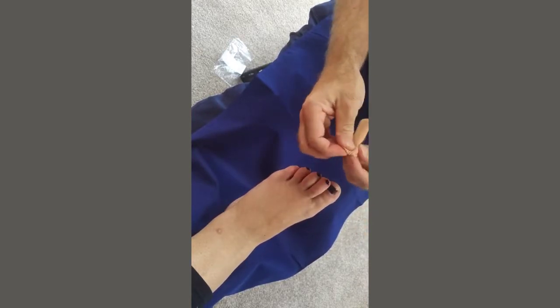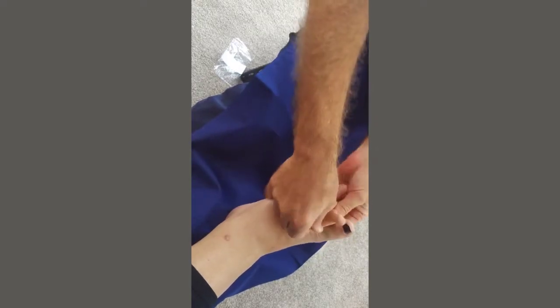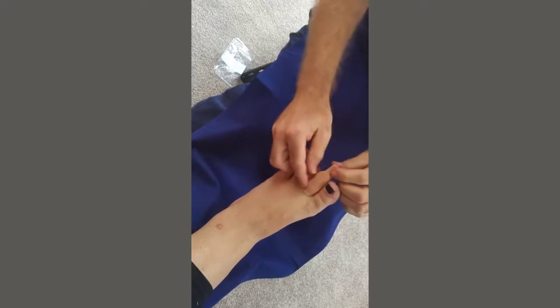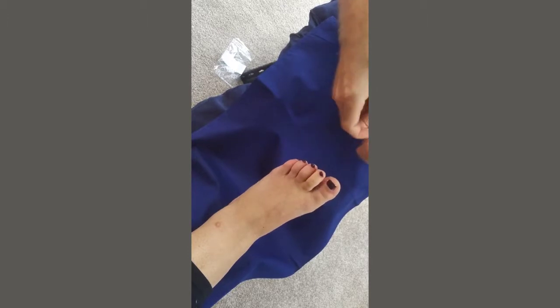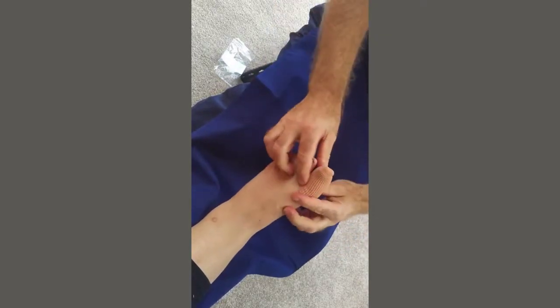You'd cut it to length and then put it over the toe. If I show you this on the second toe, you'll see that it is too long and would need cutting at the base here to get it to the right length. But if we put it over a big toe, where we have to stretch it wider, then it will fit better in length, like that.